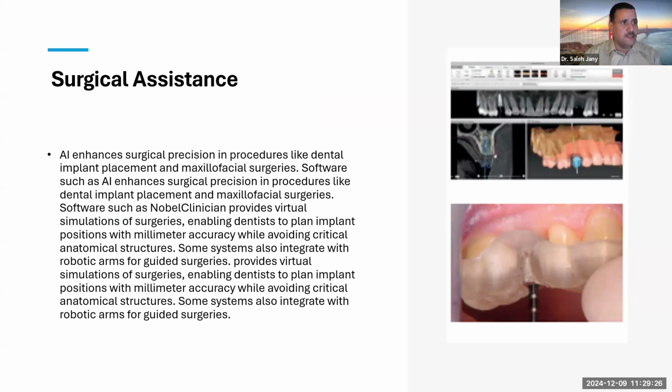Surgical assistant. Now remember, we can do a surgical guide, but we can also use a robot like Yomi. It's a surgical guide, but a more expensive surgical guide, and because it knows the anatomy, the condition, the space, and the future of that.